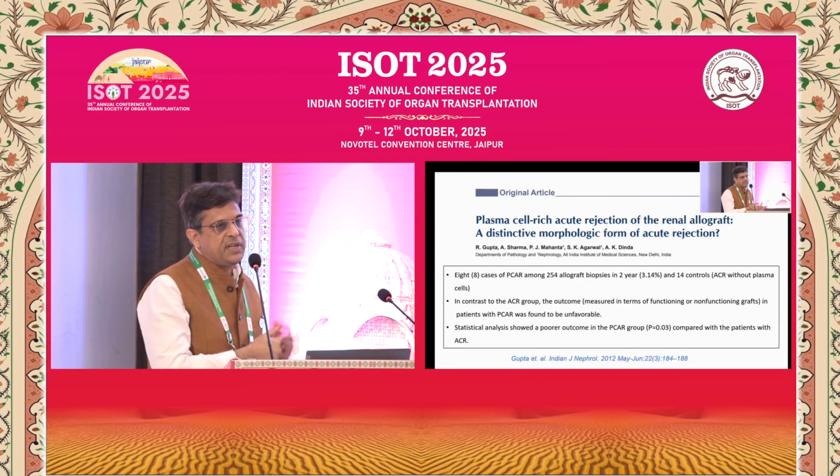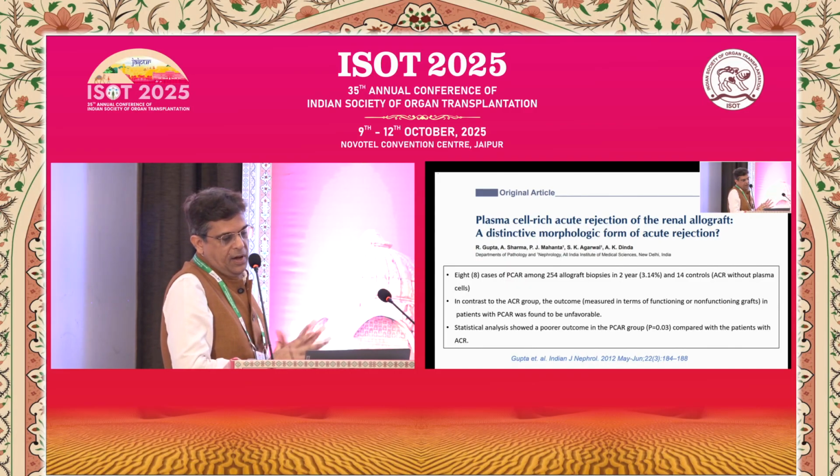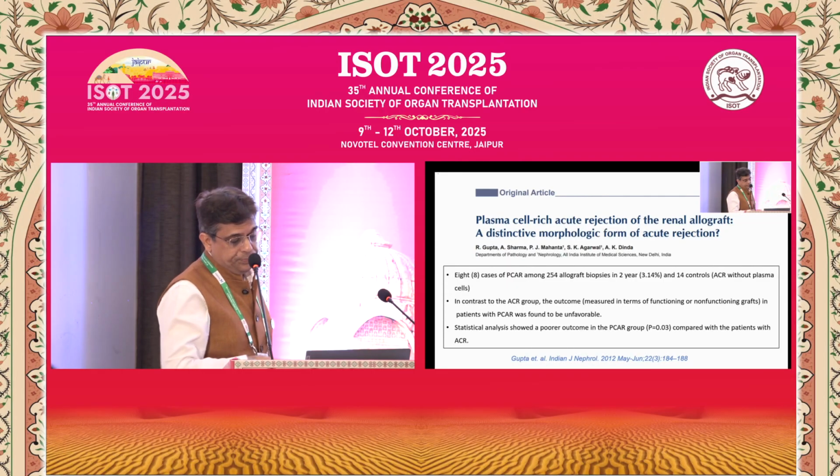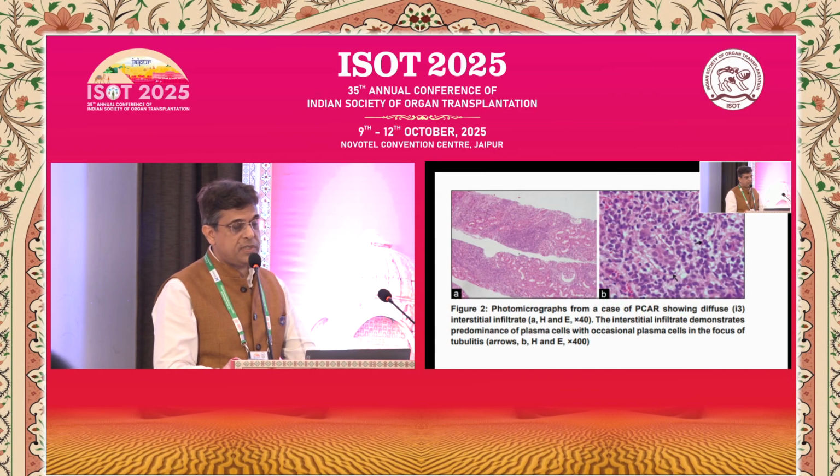So it was statistically significant. All of the grafts which had PCAR showed a very poor outcome compared to the control population. And this was the first study from this part of the country. These are a few images from this paper.